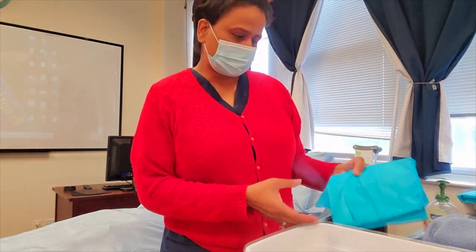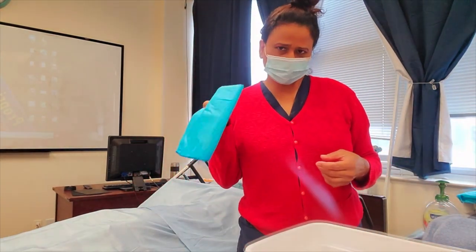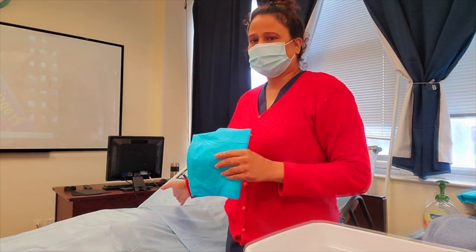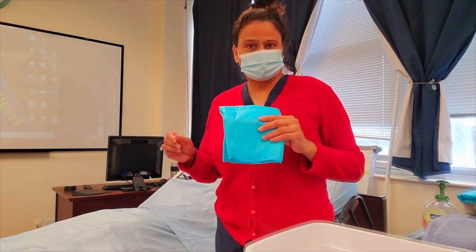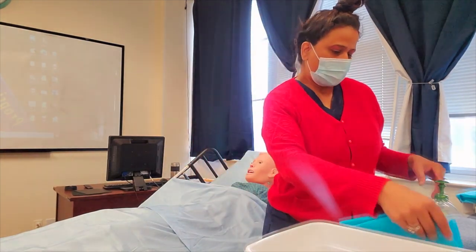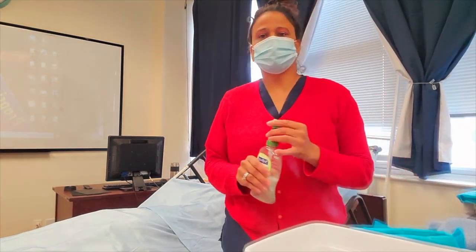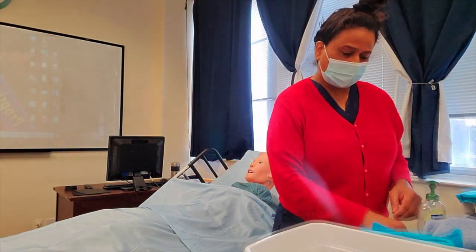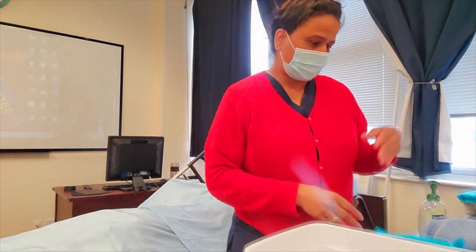The first thing — my equipment for this skill: I need a chuck to place under my patient to protect the bed from getting soiled. I have soap and I have several washcloths.